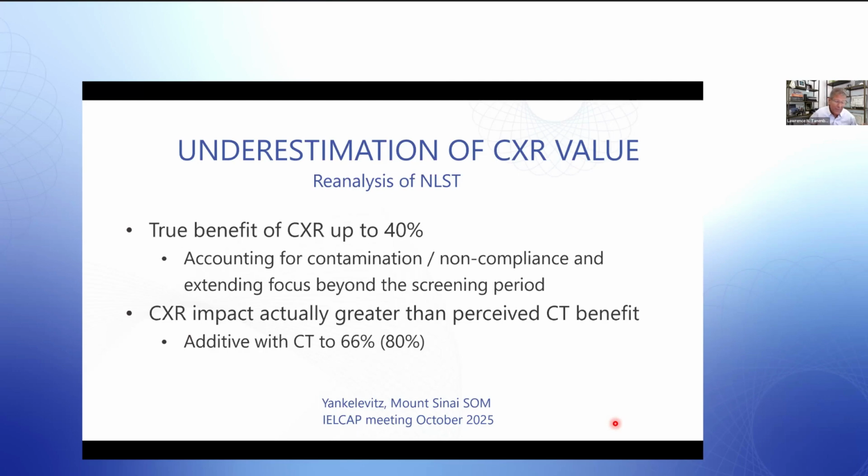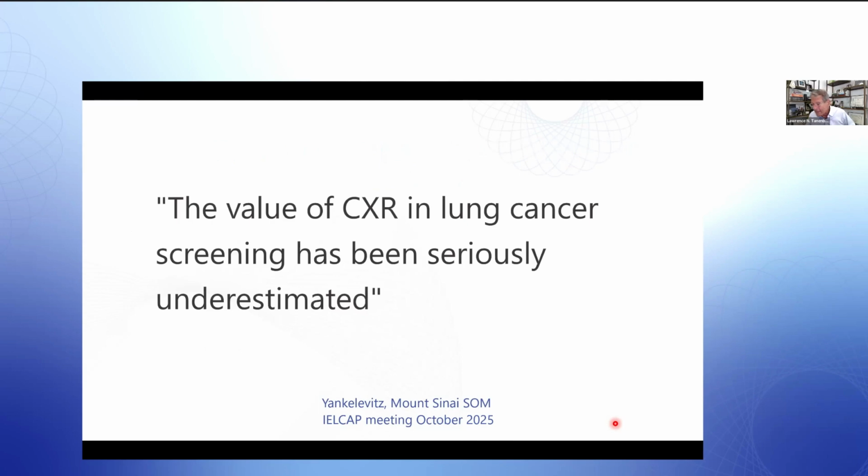As a matter of fact, the impact of chest X-ray is now seen to be even greater than the impact that CT was perceived to have that led to the reimbursement and the endorsement of the better outcomes in these circumstances. If indeed you started with a screening program with a chest X-ray and went to CT when you needed to, you could get as much as 80% better benefits. So I think the key point here for you to take home for this particular piece is that the value of chest X-ray in lung cancer screening has been seriously underestimated.